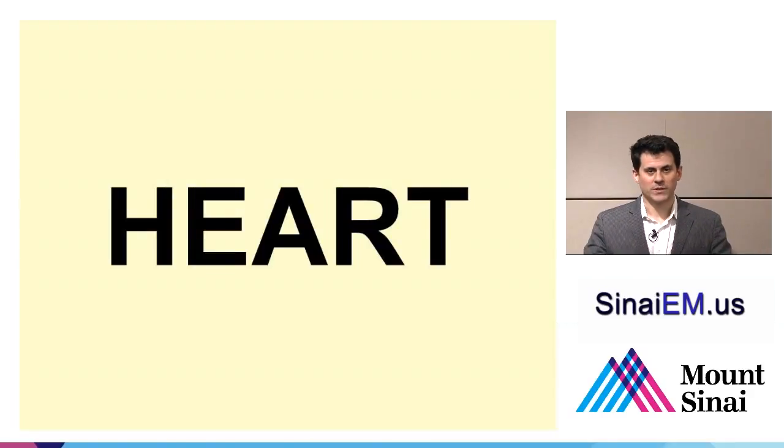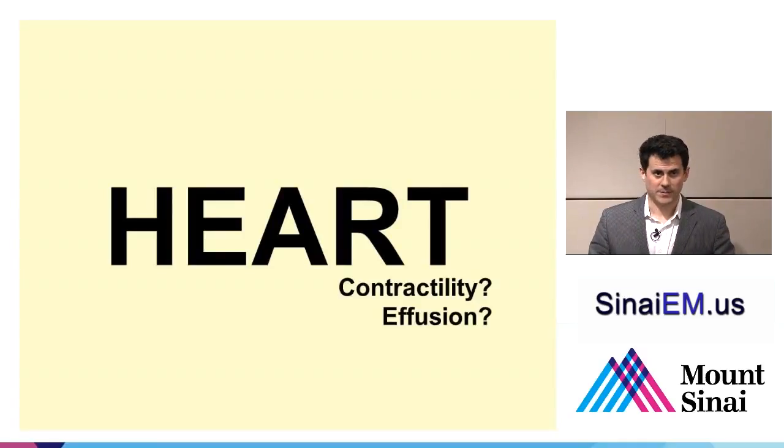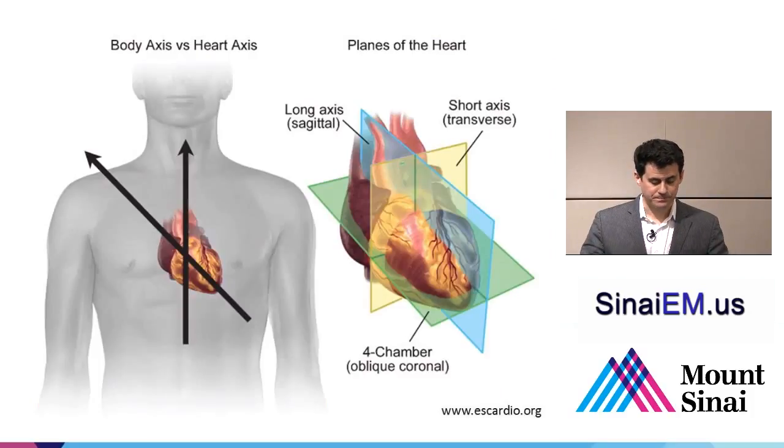So two major questions that we want to focus on when speaking about ultrasound of the heart: What does the contractility look like, and is there a pericardial effusion? Obviously, there are many, many more applications than this, but in order to get a good sense of the heart function, we can use this rough guide towards taking our first steps at cardiac ultrasound.